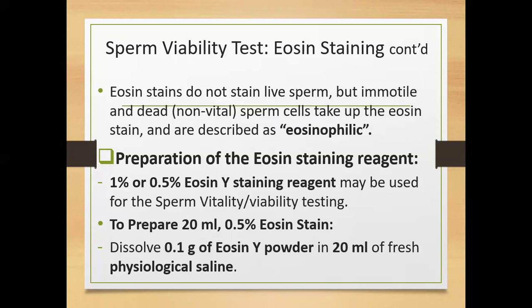Scientifically, I would prefer 0.85%, even though 0.9% is also correct. But if you are doing any scientific write-up, quote 0.85%, even though 0.9 is not wrong.